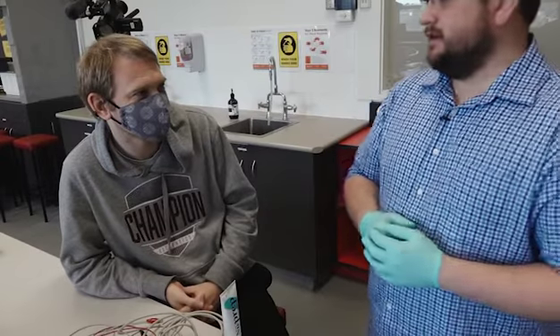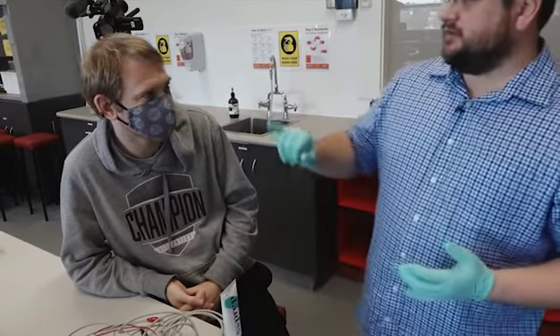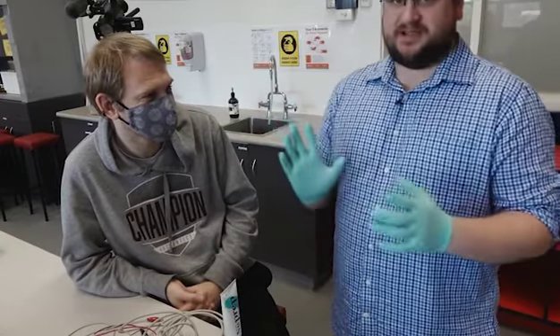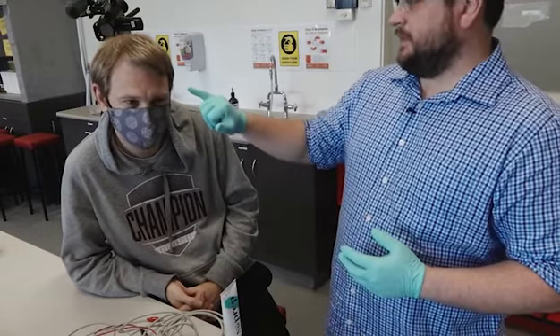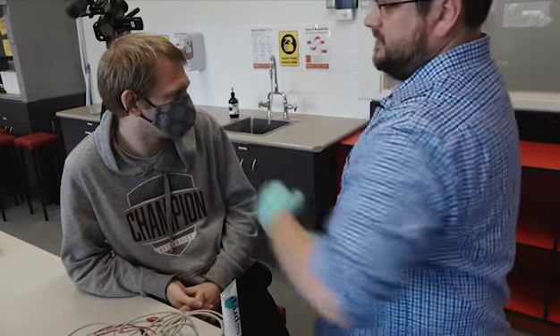The first thing we're going to do for the EOG task is identify where we're putting our electrodes. We have 2 recording electrodes and 1 ground electrode for this setup. On our participant, the ground electrode will go in the middle of the forehead, and the recording electrodes will go on the temples, either side of the lateral canthus, that's the outer corner of the eye. The positive electrode will go here on the left, and the negative electrode will go here on the right.